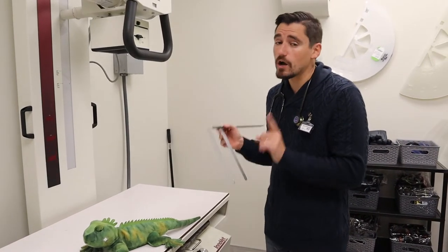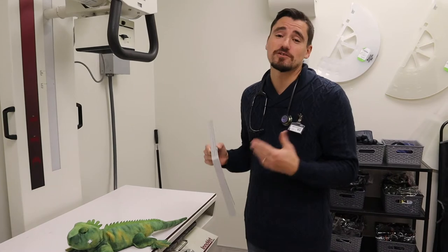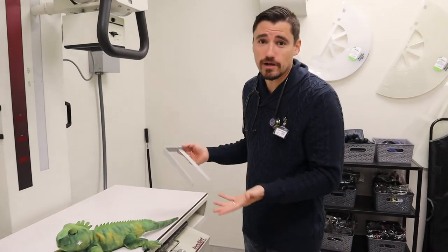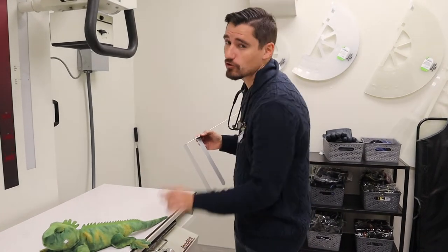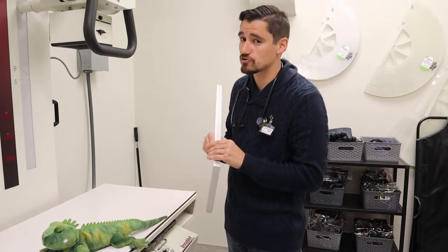This will adjust how much exposure of x-rays my patient has. If I overdo it or underdo it, my x-ray is going to look horrible, and then I'll have to redo it or send it to a specialist — and they'll say Dr. Danny did a horrible job, retake it. So it's important to measure correctly and set the machine correctly for the best picture.